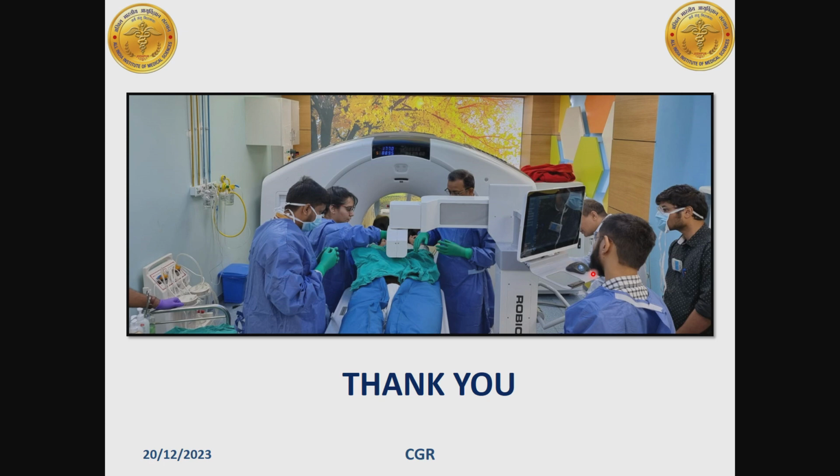This robotic arm is not available at all the centers, so without it also one can manage. But this is definitely an advantage because it is real time based. When you do a radiological CT guided biopsy with PET fused images, not fused, it is basically registered. If the software is there, you fuse, otherwise you do visual registration. At that time, patient position may change. The CT is not done in the same position, and some kind of changes may happen. But here it is real time, so we can always target the lesion better. That is the advantage here.